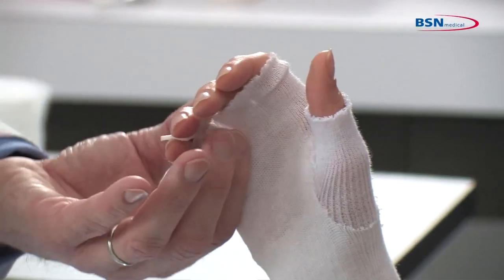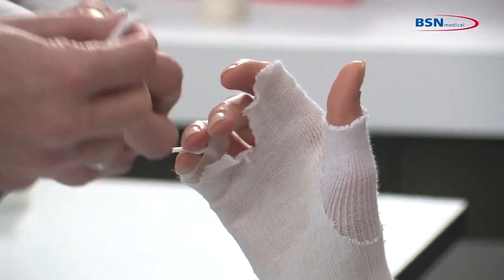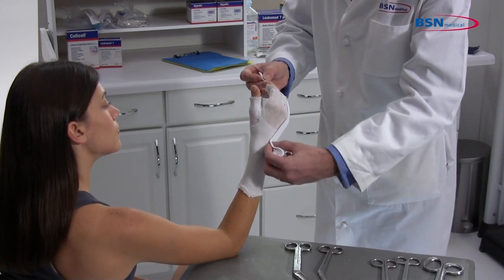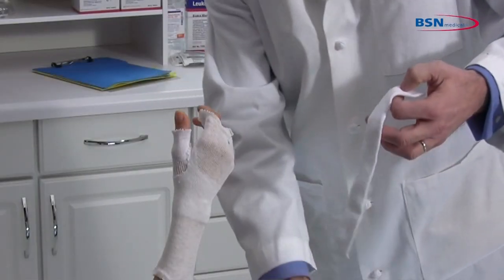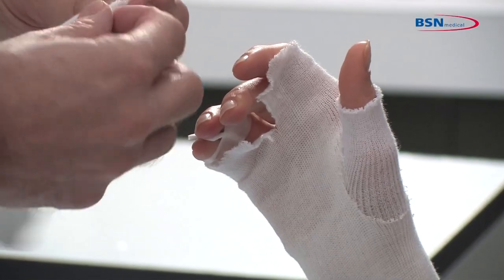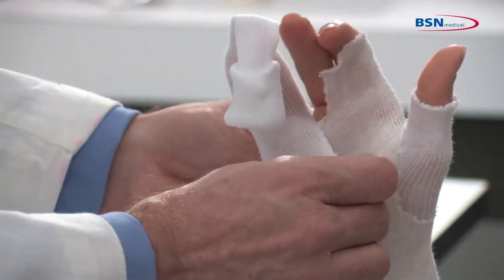Cut the stockinette between the third and fourth phalange. Using a one-inch stockinette, cut a length long enough to be used from the distal phalange to the wrist. Make a two-inch cut at one side and roll up. Slide the stockinette over the fourth and fifth phalanges and remove wrinkles and creases.